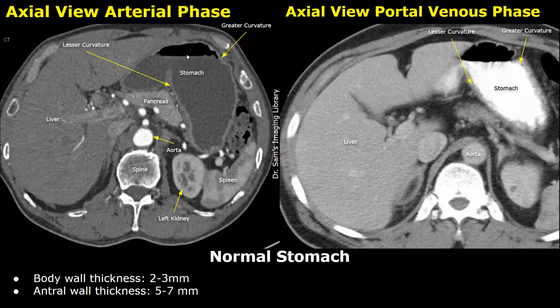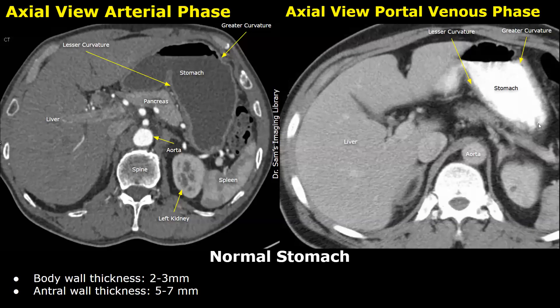Normal peristaltic activity can cause variations in the stomach's appearance, with temporary changes in the shape and thickness of the gastric wall. The image on the right shows the stomach filled with positive oral contrast medium such as barium sulfate. Positive oral contrast media will make the stomach lumen appear bright or hyperdense, improving the delineation of the gastrointestinal lumen and wall.